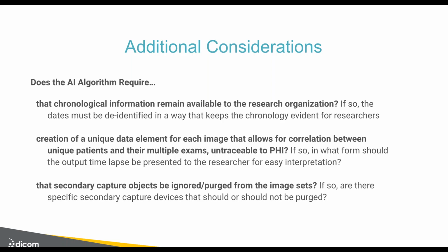If you don't know what you're intending to do with the data set, then the answer to that question could be any answer, right? In the case of the projects that we did, it's absolutely incredibly important that the chronology of the creation of those exams still be identifiable by somebody looking at the data sets. And furthermore, you want to be able to tell: are these 5 image data sets belonging to one patient, and they're all relevant priors for one patient, or do they belong to 5 distinct patients? Because you've de-identified all the names and dates of birth and all of that.